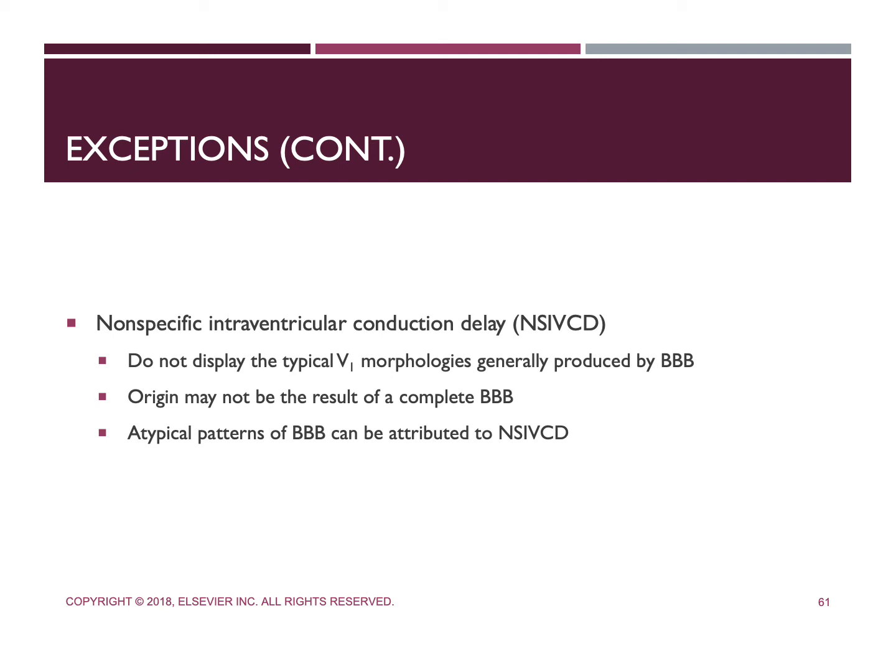So their origin may not be the result of a complete bundle branch block, but they often are the result of several factors, of which incomplete bundle branch blocks may be one of them. So atypical patterns of bundle branch blocks can be attributed to the NSIVCD here.